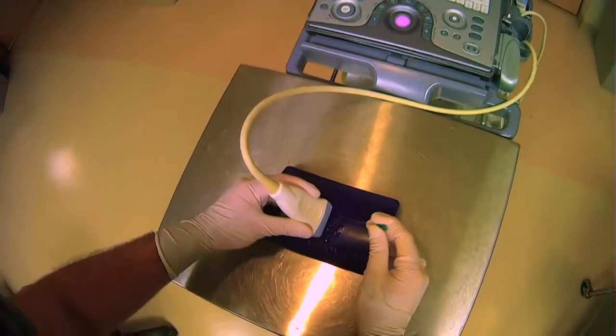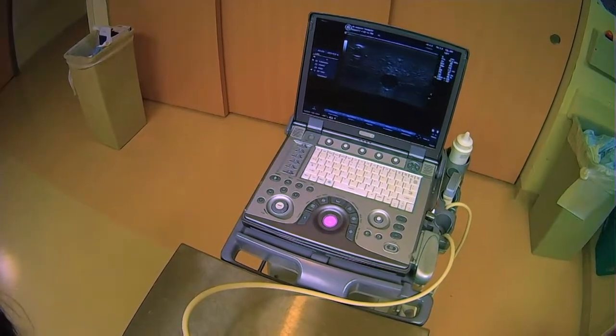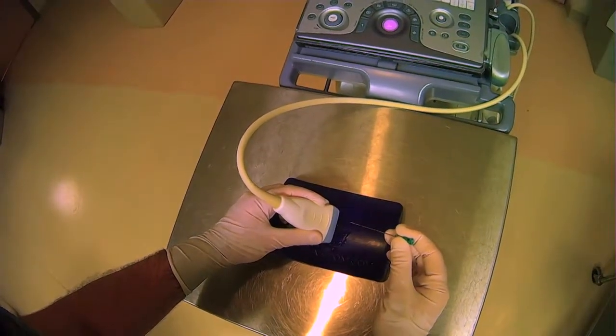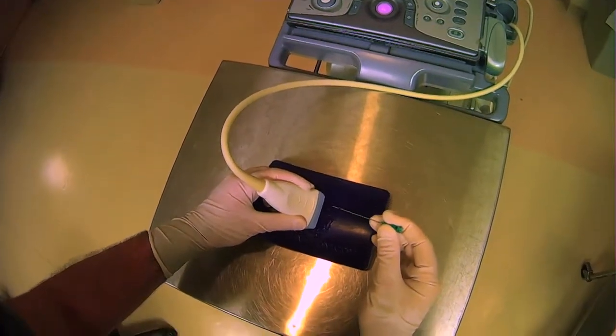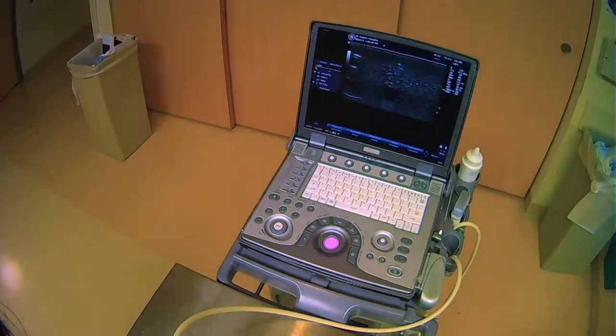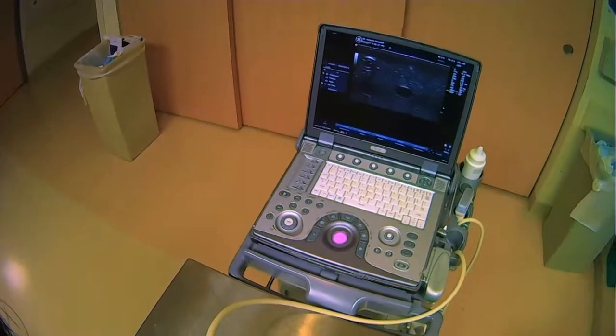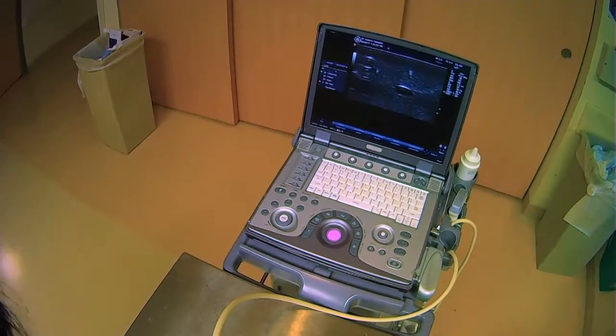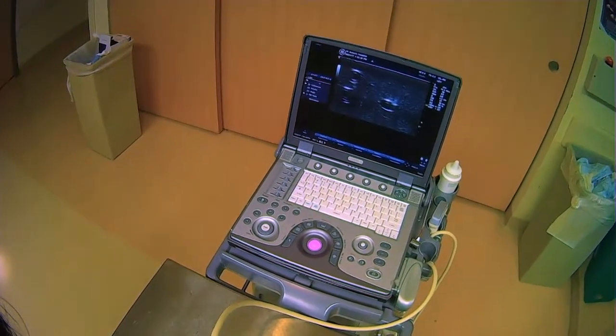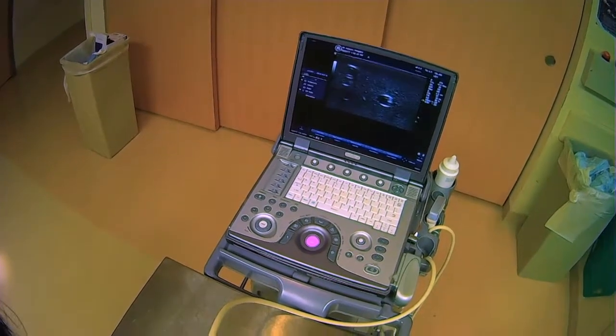So I'll just show that one more time. We found our target here, we've obliqued our ultrasound probe like this away from where we're inserting, we go still in the center but we already see the tip there, as we get deeper we shift our hand like so and we just track the needle all the way down into the vessel and we find the tip just like that.